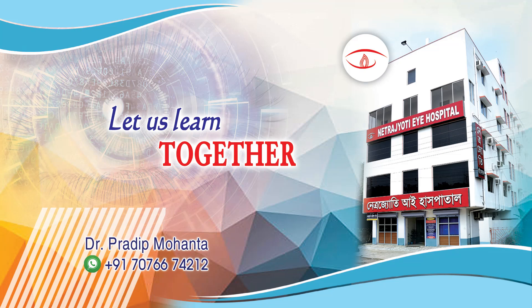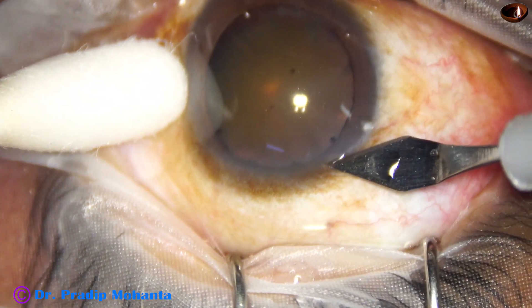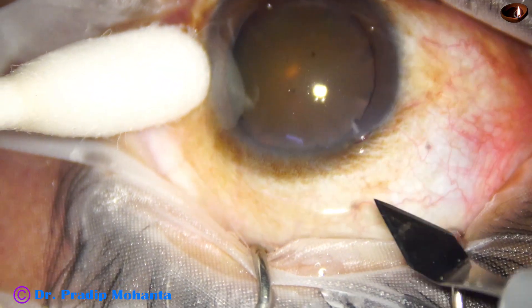Welcome to my workplace at Ranagh Heart, West Bengal, India. Let us observe this totally unedited, real-time phacosurgery under topical anesthesia.